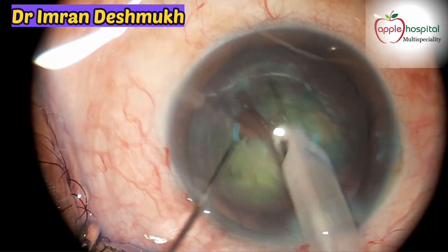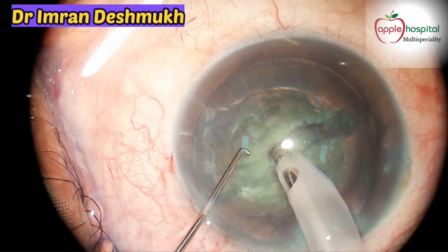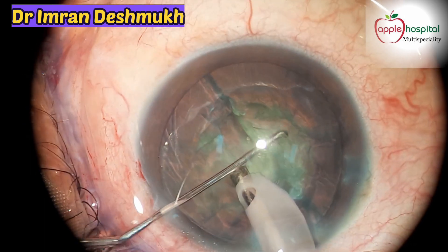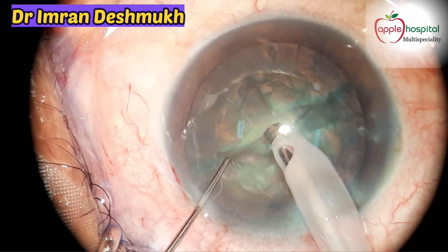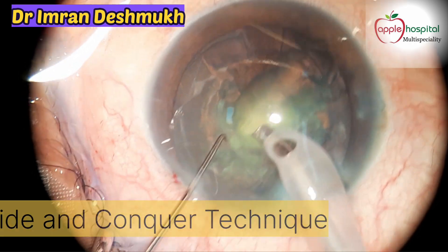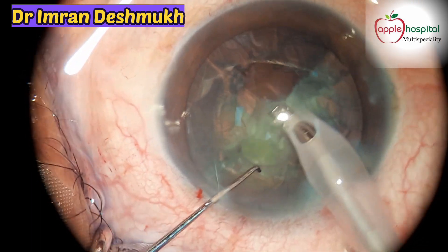That's a nice divide — it's been divided into two parts. We were going for stop and chop, but as the nucleus is very soft that becomes very hard, so I've decided to go for the divide and conquer technique. You can see how soft it is — it can easily be divided into four parts.